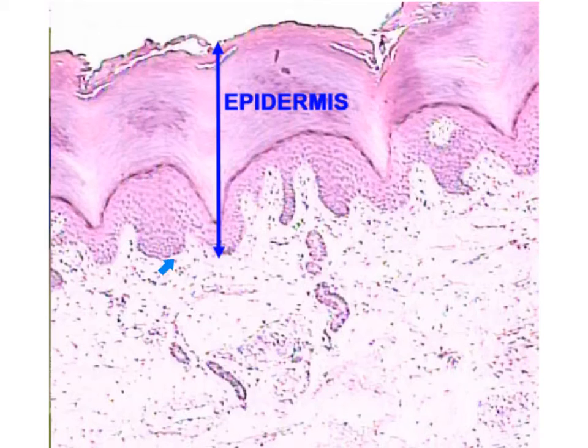And this was designed to help with grip. Without this layer, we would not have the ridges on our hand and therefore would have difficulty gripping objects. From here down, we would have the reticular layer of the dermis. So we have our epidermis with our sublayers, the strata, and we have our dermis with our sublayers, the papillary and the reticular.